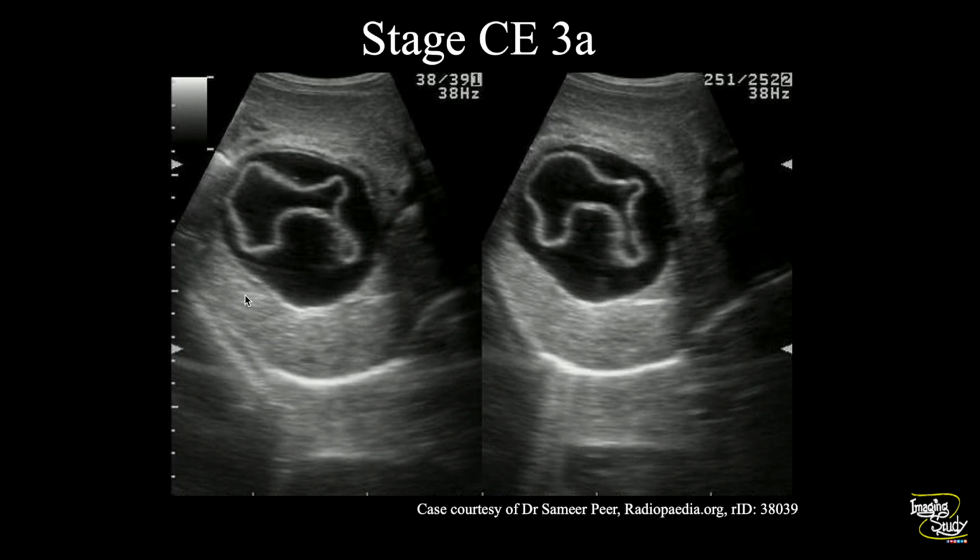You can see a well-defined cystic lesion in the right lobe of the liver with low-level internal echoes. It shows a detached irregular laminated membrane inside it which appears to be floating within the contents of the cyst. This appearance is commonly known as the water lily sign, and according to the WHO classification, it is classified as stage CE3A, which represents the transitional stage between the active and inactive disease.